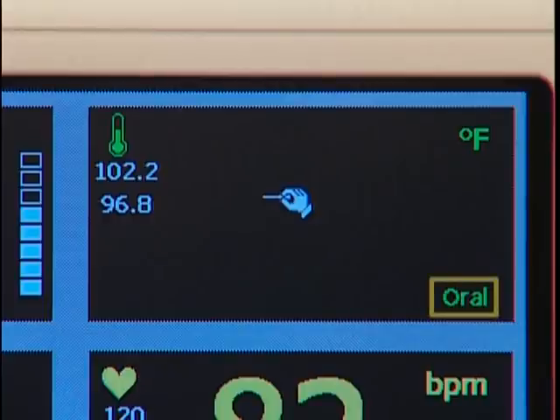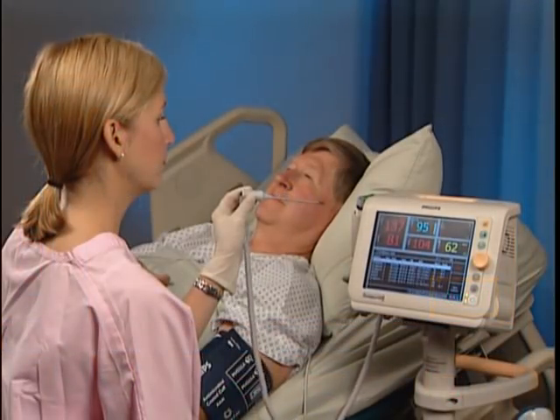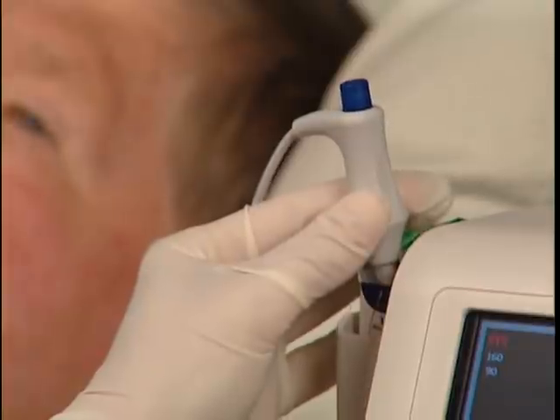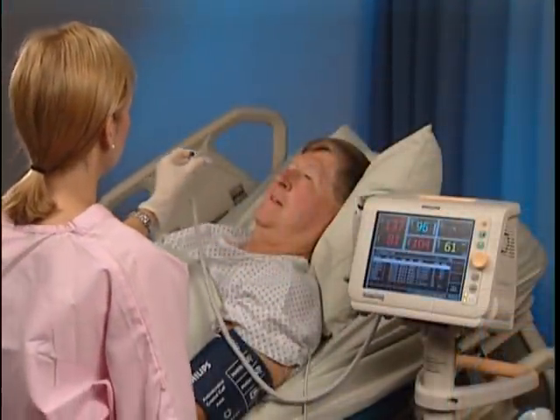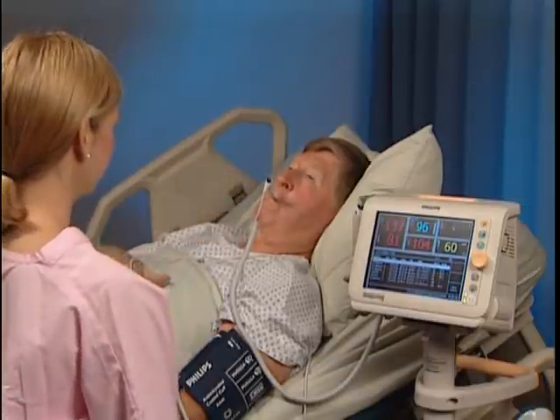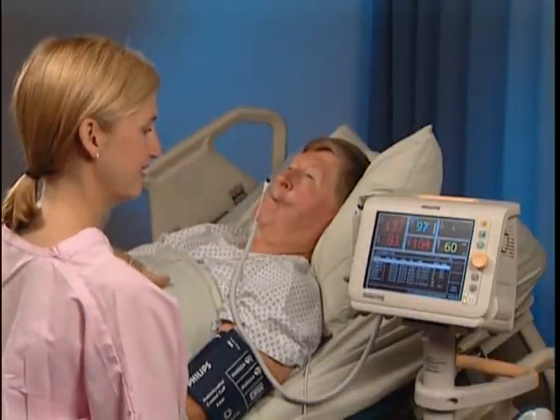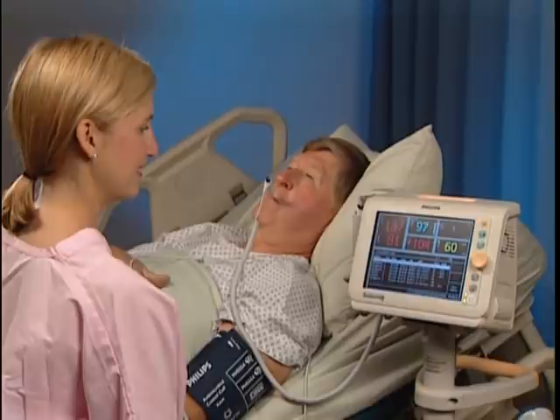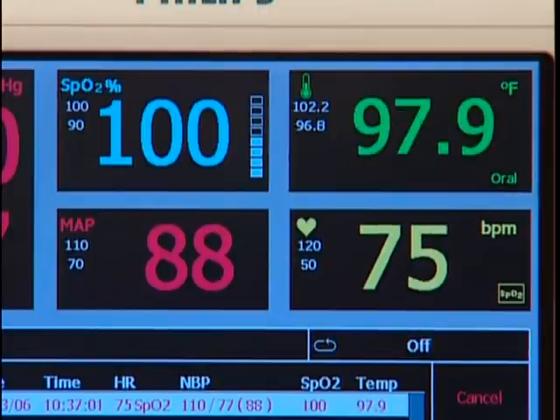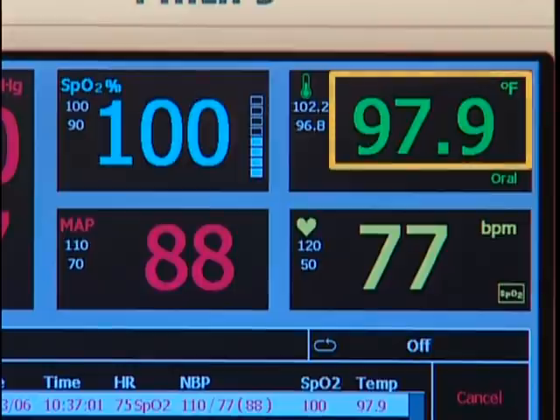Make sure that the correct probe site is selected. Be sure to attach a probe cover before placing the probe. The monitor measures the patient's temperature in approximately 4 seconds when measuring orally and approximately 16 seconds when measuring axillary or rectally. An audible tone indicates that the measurement is complete. Temperature is displayed here.